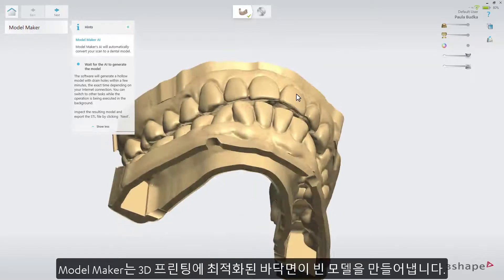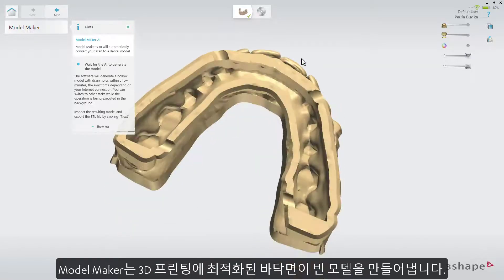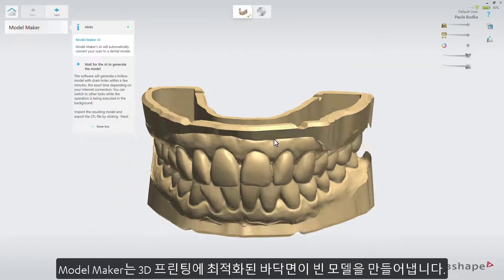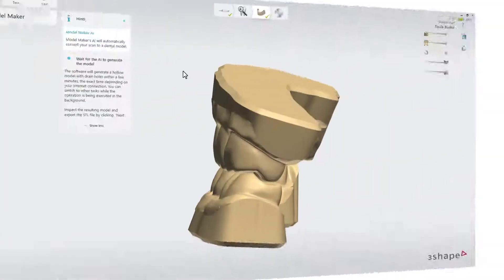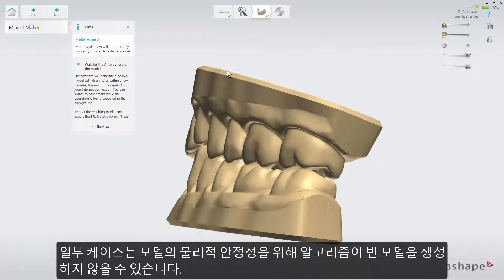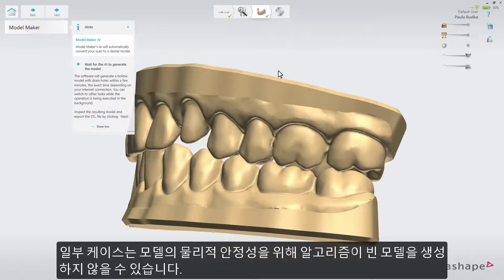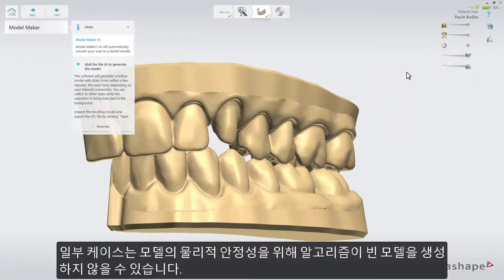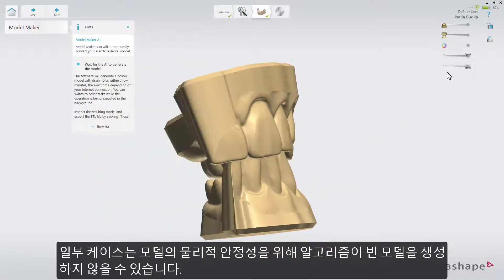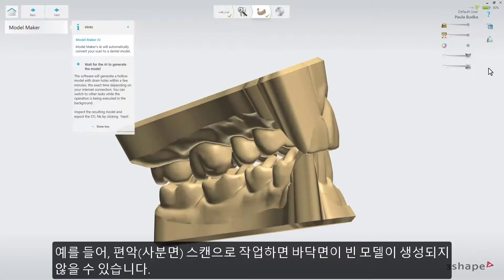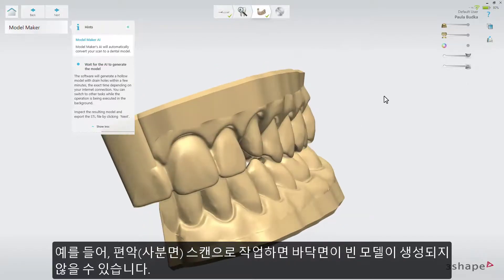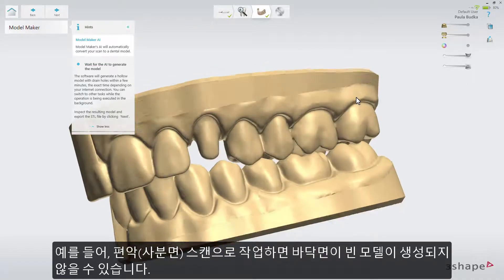ModelMaker will produce a hollowed model, optimized for 3D printing. In some cases, the algorithm will not include hollowing, to ensure mechanical stability. For example, if you work on quadrant scans, they might not be hollowed.